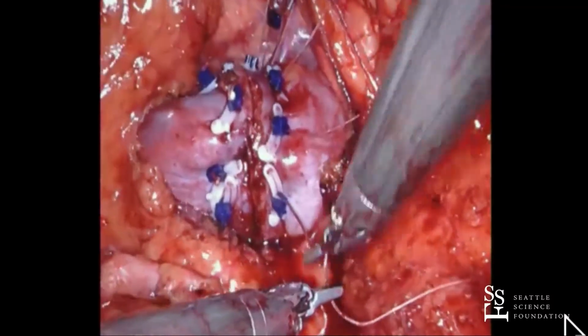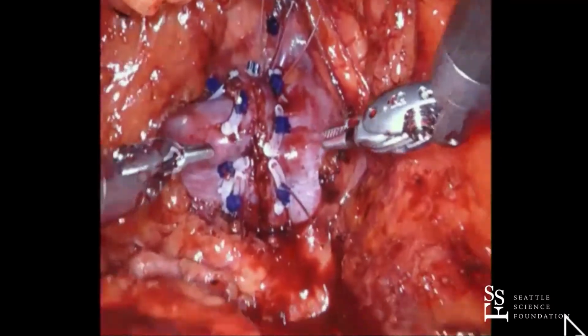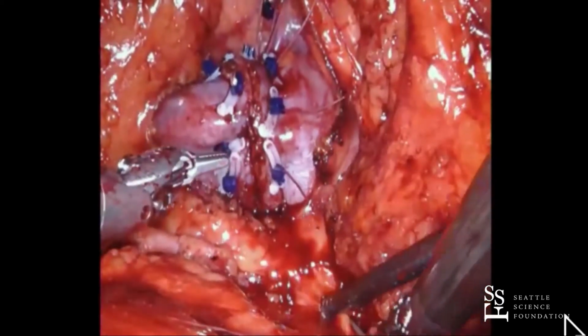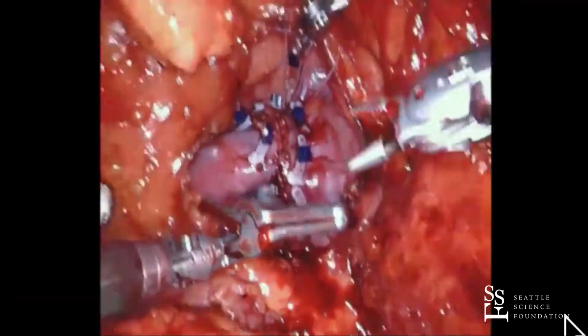Exactly. And we routinely test that at the end. I think it's a good idea. And so as we're learning, you can actually affect global volume loss over time with how much of that extra tension you put on. There's definitely a balance between how hard you crank down and how much kidney you're actually saving in the long run.